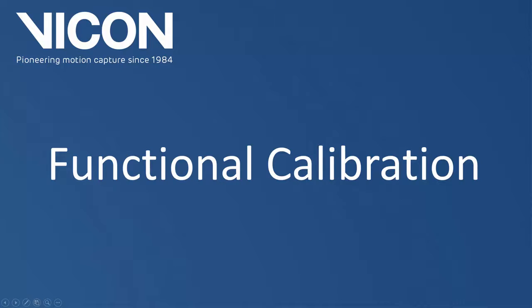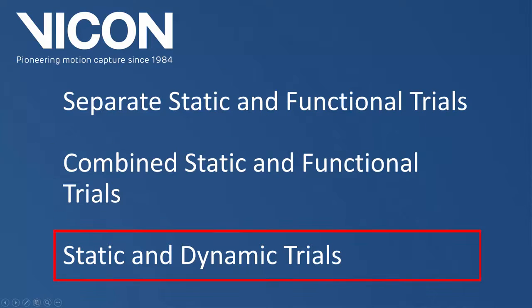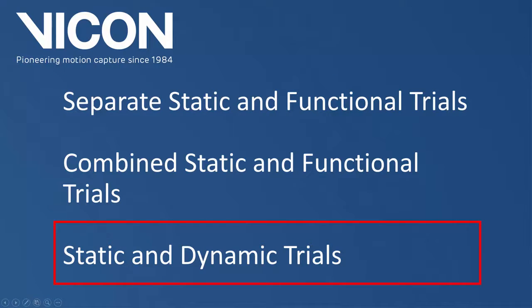For all subjects where you want to use a custom VST, make sure that you have at least a static and a functional trial. There are different ways you can do this. The first is to capture separate static and functional trials. The second is to capture a single functional trial where the subject starts in the base pose. And the last is to capture a static trial and use one of the dynamic trials for the functional calibration. The first two methods are the preferred workflows while the third would be used in cases where a functional range of motion trial may not be possible.